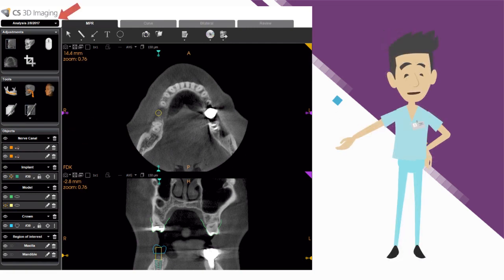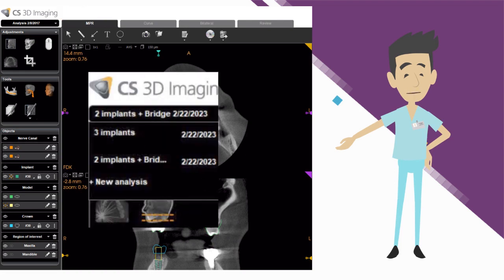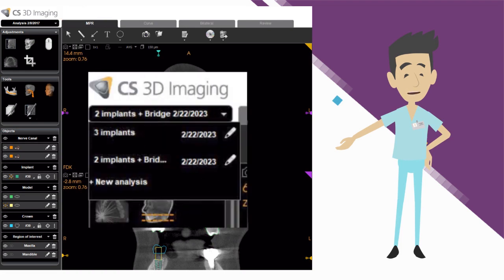The new analysis management dropdown is available in the upper left corner of CS3D imaging. It allows users to easily create different and distinct treatment plans from the same volume.